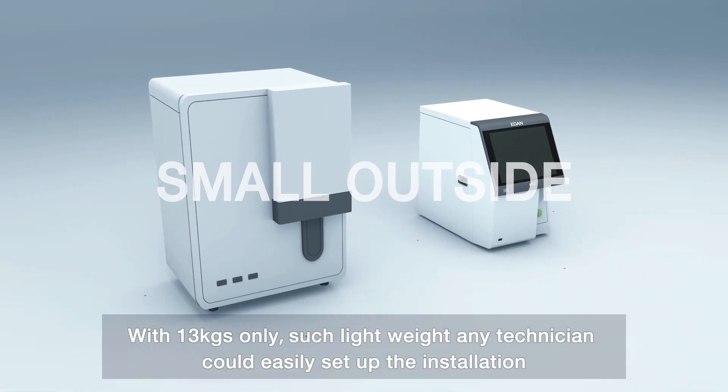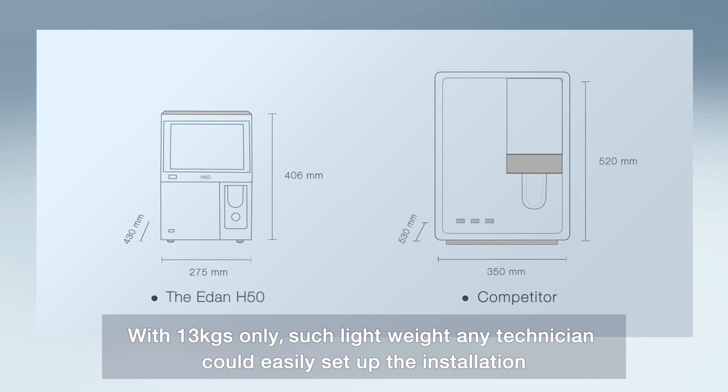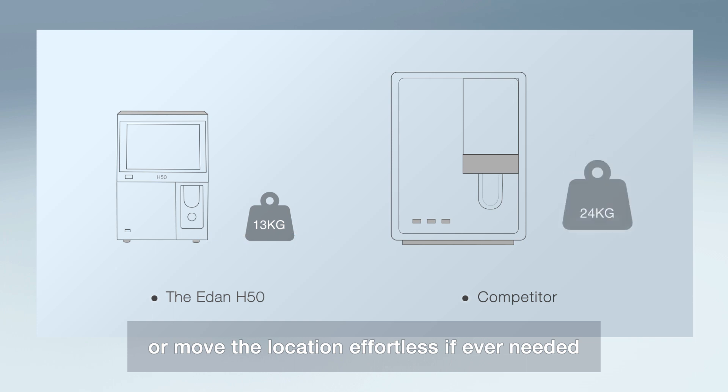With only 13kg, such a lightweight design means any technician could easily set up the installation or move the location whenever needed.